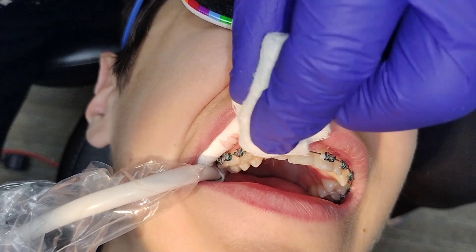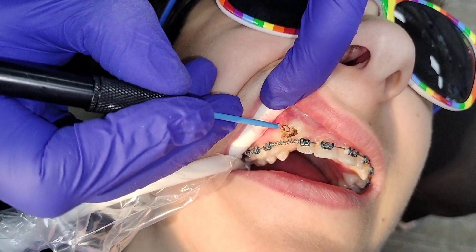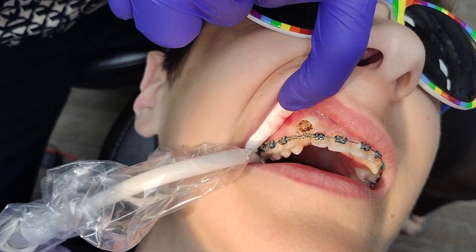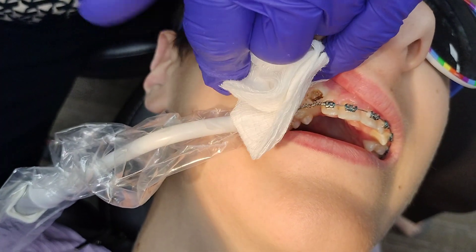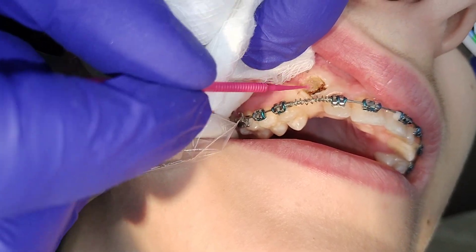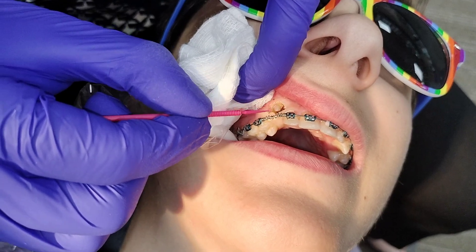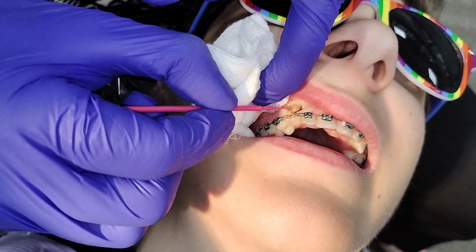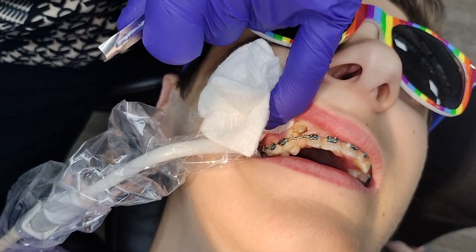All right, that's enough to put an attachment. We're trying to keep this in the attached gingiva, otherwise we're going to have recession. So all I needed is three millimeters of tooth structure exposed. A little bit of air.